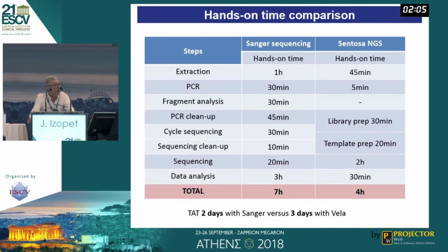When we compared with Sanger sequencing, there was a reduced hands-on time of 3 hours, because the hands-on time for Sanger sequencing was estimated at 7 hours. However, the TAT was 2 days with Sanger versus 3 days with Vela.